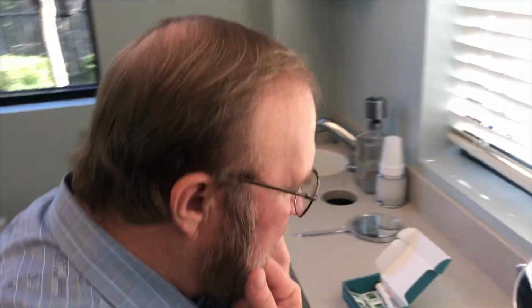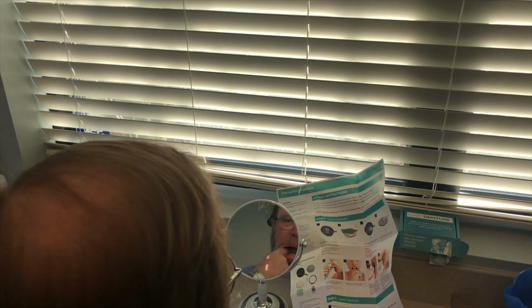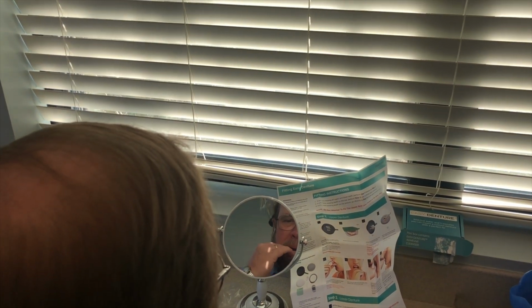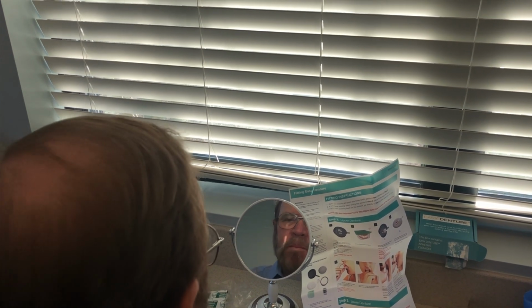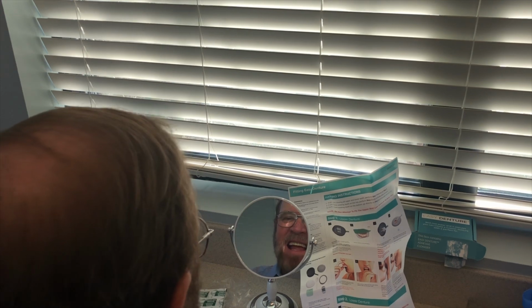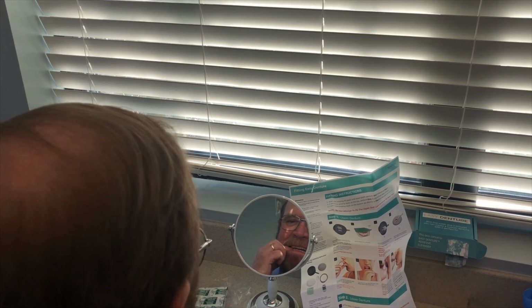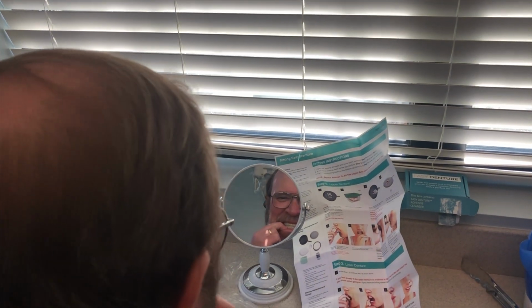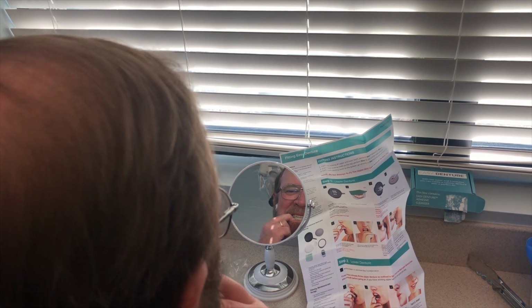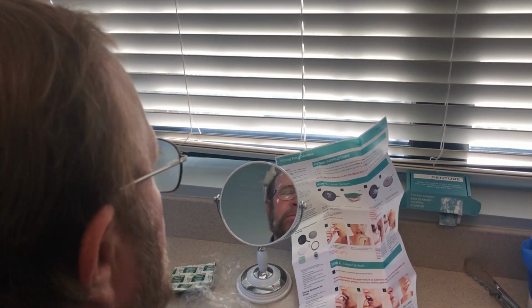And then you just want to line up the bite so it goes in and out. You can push it in on the sides. You can bring it out on the sides to get the bite to line up. Perfect for it. And you want to adapt the ridge. So it feels like it just wants to adapt, right? I mean, you could move it around where you want it to.